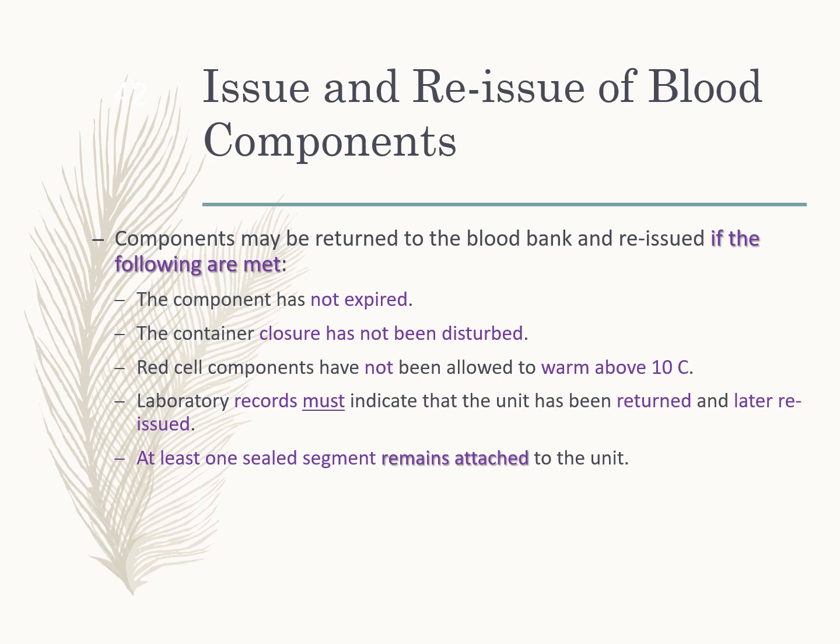That nurse can't say, oh, well, my other patient needs blood, so I'll just take this unit down to them. It has to go back to the blood bank, and they have to retag it for that other patient. And one sealed segment always has to be attached to the unit.